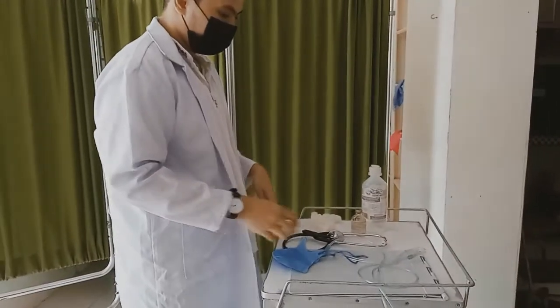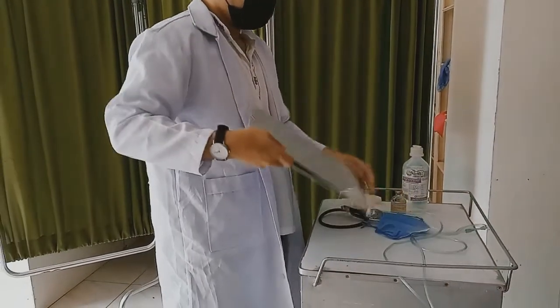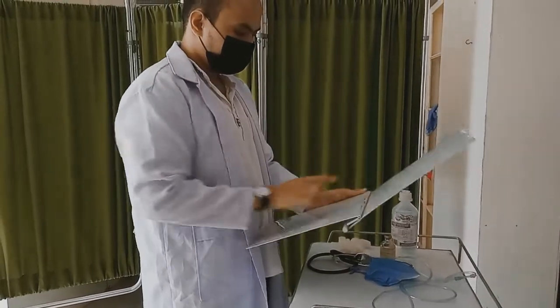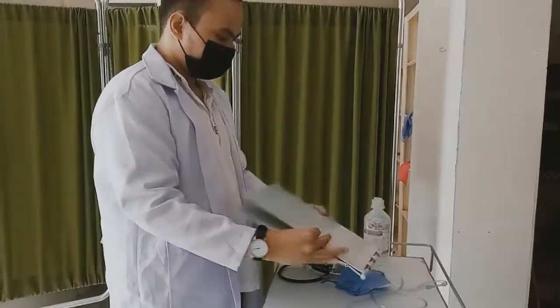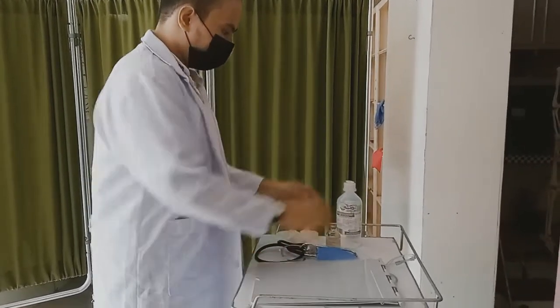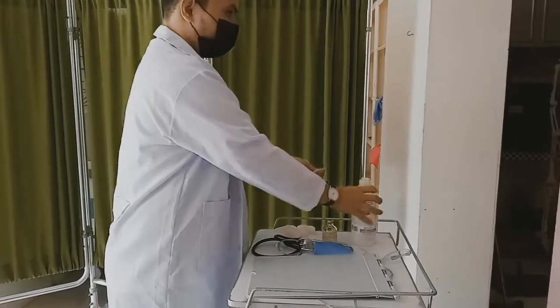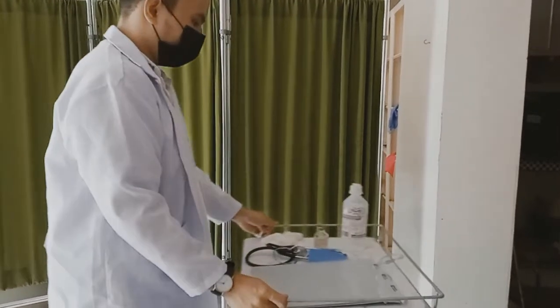Gather equipment. Check each medication order against the original order in the medication record according to facility policy. Clarify any inconsistency. Check the patient. Check for allergy. Know the action, special nursing consideration, safe dose range, purpose of administration and adverse effect of the medication, and check the appropriateness of the medication for this patient.